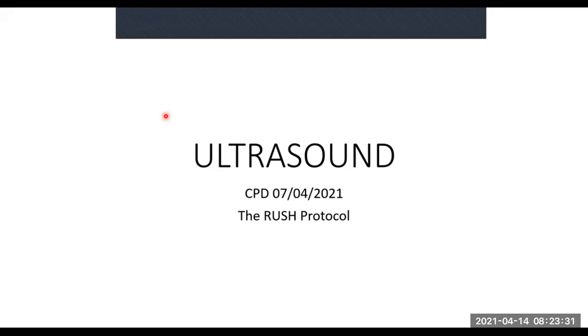So the easiest way to think of shock: shock depends on the heart and it depends on your blood vessels. So for the remainder of this talk, I want you guys to imagine that your mouth is the heart, the pump, and you've got a straw in your mouth. Your pump is trying to push through the straw, and that's how we're going to describe each and every shock. That's the easiest way that I found for people to understand. We were supposed to have this last week, but we didn't, so we'll have it this week.